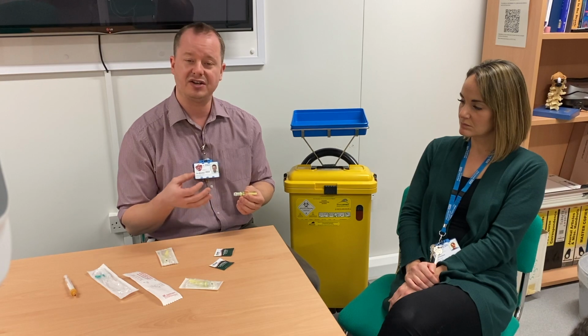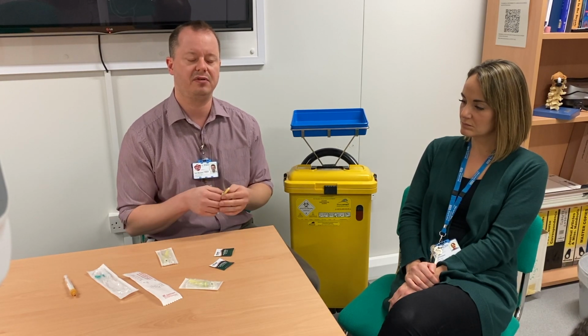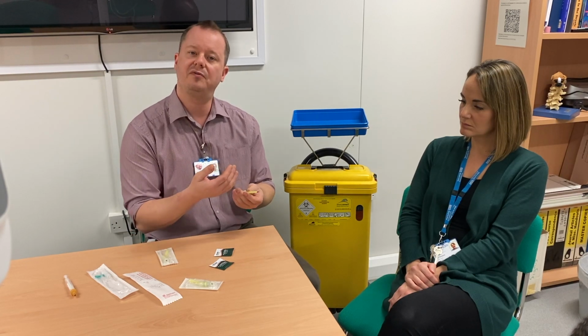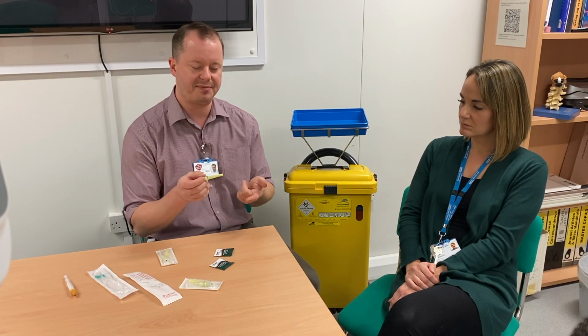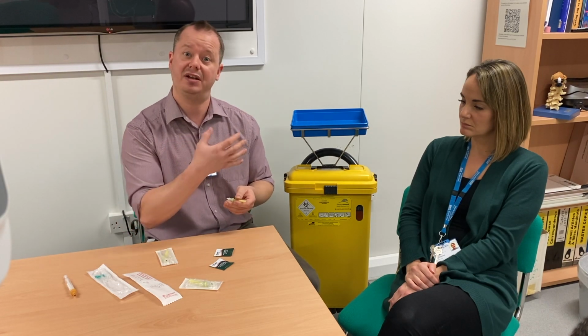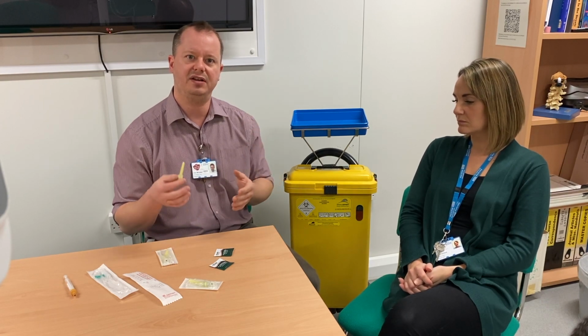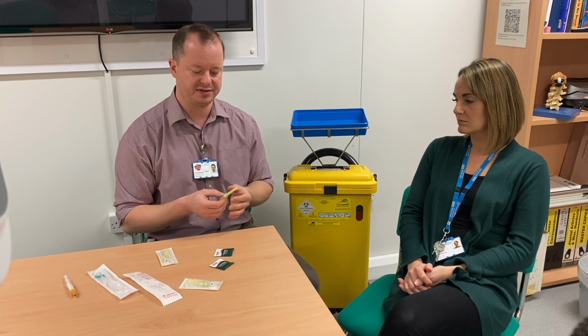It's important to note that needles are a particularly dangerous device to be stabbed by, because needles in healthcare are actually hollow. So if you've used it to take a blood sample, for example, it will be full of blood, and if you actually end up stabbing that into your skin, it can inject quite a large contaminant into your skin. So it's worth noting that you need to be extra careful with needles.